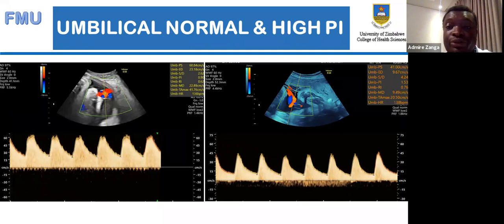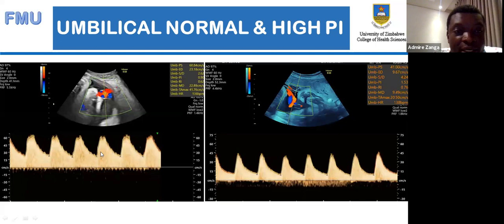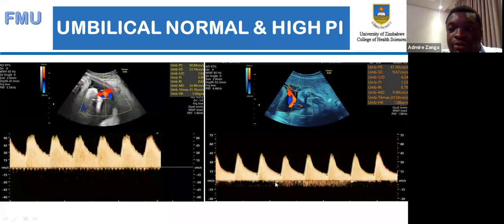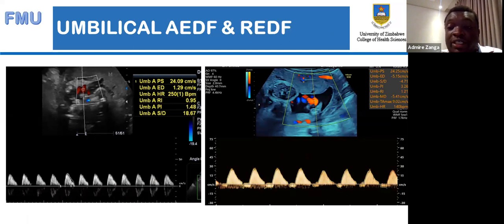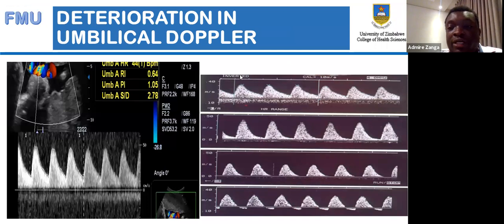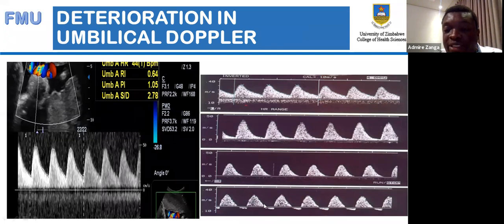For the umbilical artery, which is part of surveillance, it must also have good end-diastolic flow. When end-diastolic flow starts to reduce, it becomes a high PI. As it continues to deteriorate it will become absent — during diastole there will be no flow — and then it will become reversed, meaning the baby is deteriorating further. This graphical representation shows the deterioration through surveillance: high PI, continuing to diminish, absent end-diastolic flow, and then reversed end-diastolic flow.